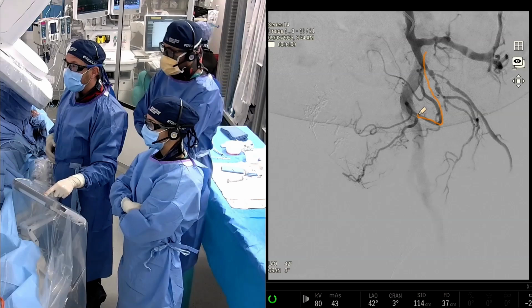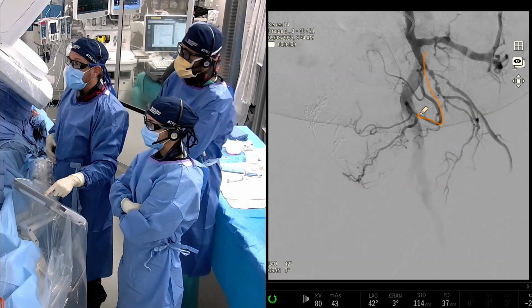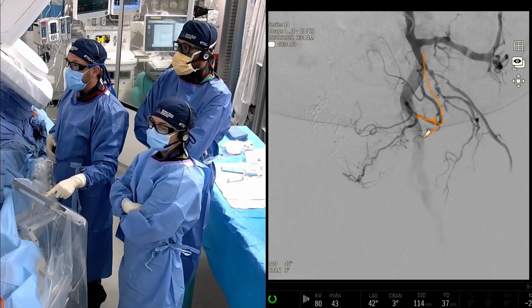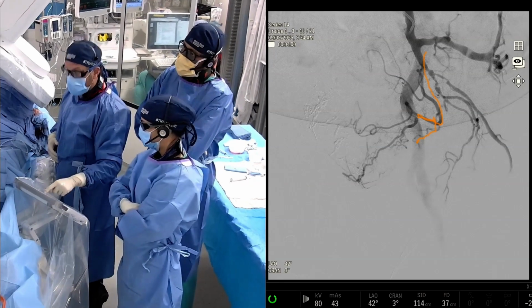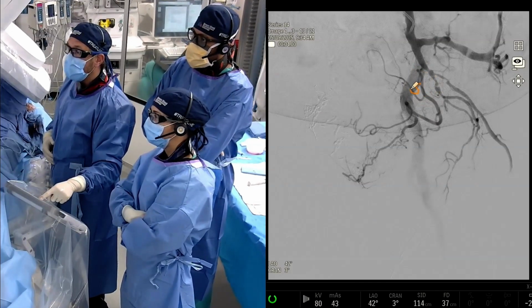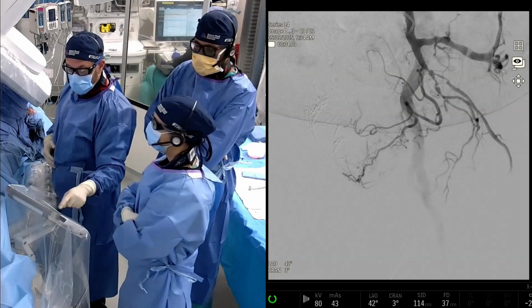Very big. It's always in these large prostates. It's usually the largest artery on that side, and then one of the branches back here is going to be the rectal artery. If we follow that out, that's going to be the middle rectal. And so the biggest question that I have on this angio is not what this is right here, which is obviously supplying the bladder, but, and I'm going to ask you guys to comment on this.